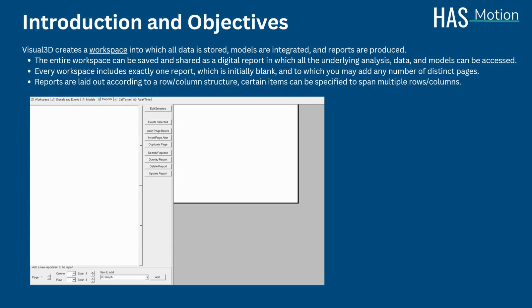Every Visual 3D workspace includes exactly one report, which begins as initially blank and you may add any number of distinct pages. As stated previously, the entire workspace is itself a kind of electronic report because it contains not only the contents of the reporting page, but also all of the original data and records of the data processing steps.